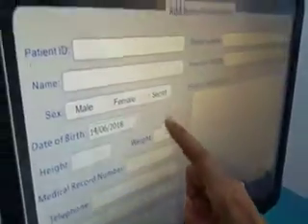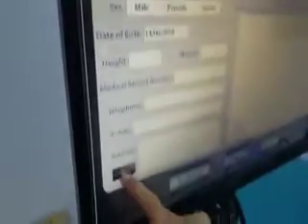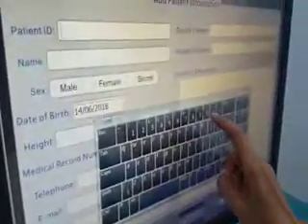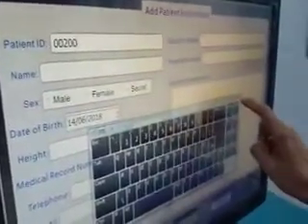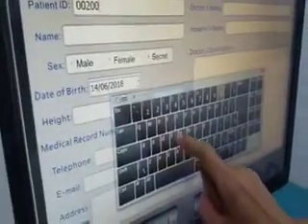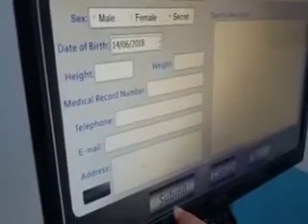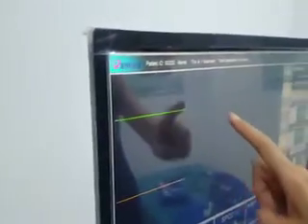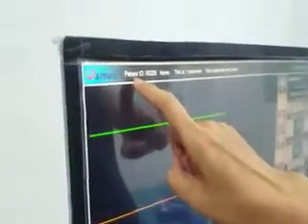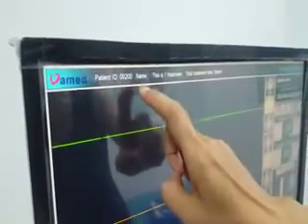Here we will give the patient an ID number. For example, we give this new patient the ID number 00200. If you want to input other information, use the software keyboard to do so. After finishing, press submit to enter the treatment interface. You can see that the patient ID number is 00200, as we assigned.